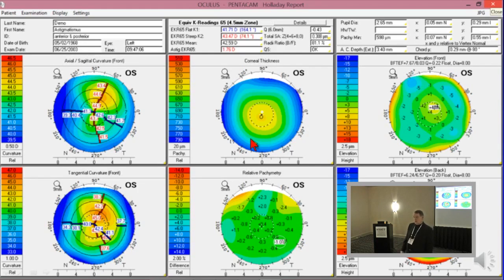Yes. That second reason, you said the total corneal power is a diopter off compared to the EKR 65? Right. Why is that again? Because the total corneal power is a net, okay? And what I'm saying is keratometrically, when you take a power measurement of the cornea with a keratometer, you get 45 diopters.